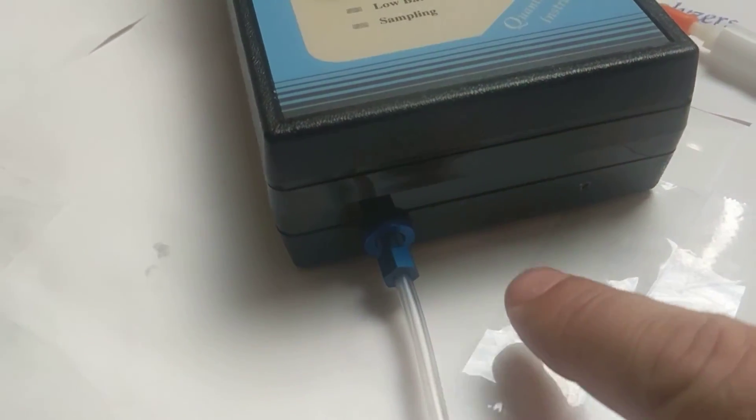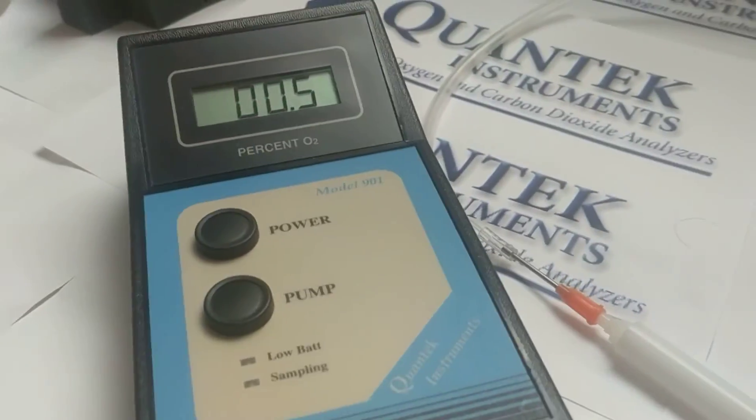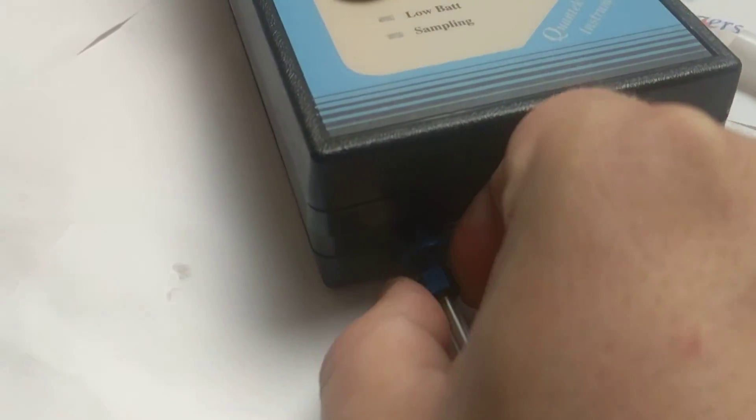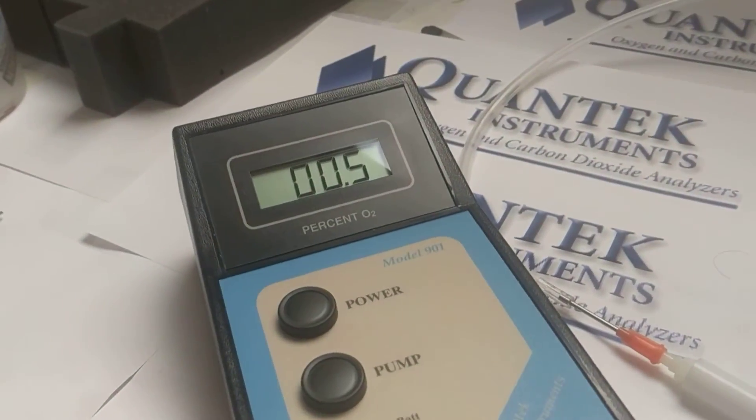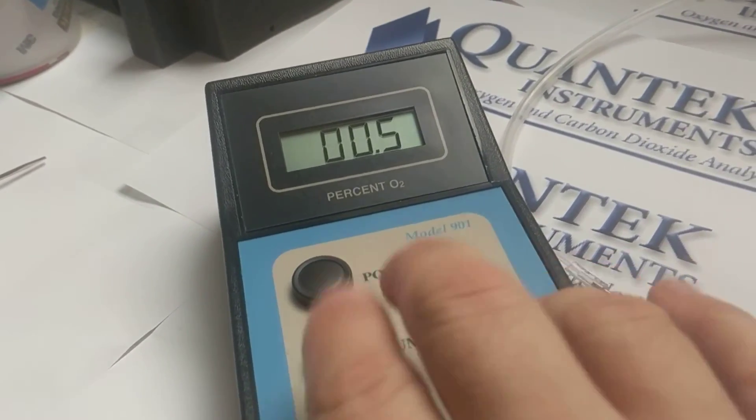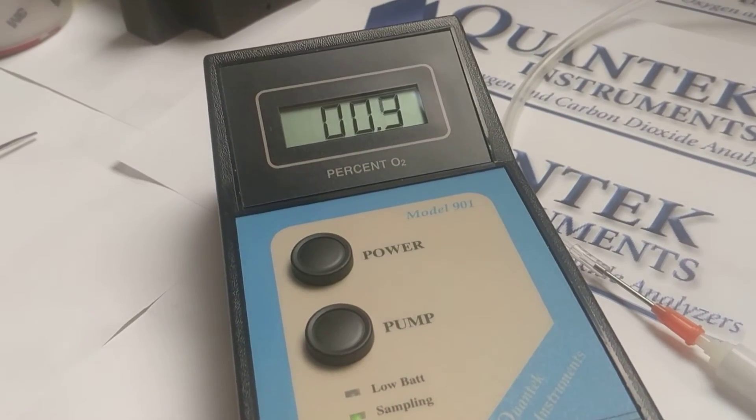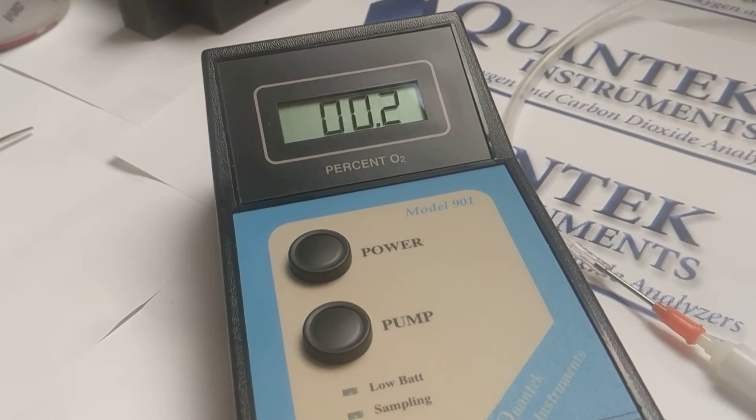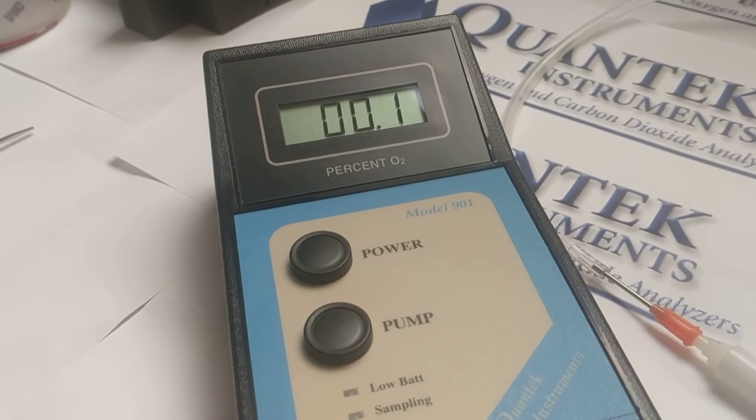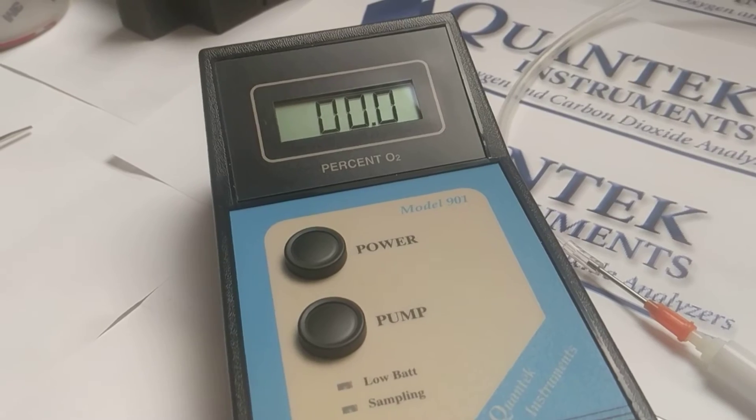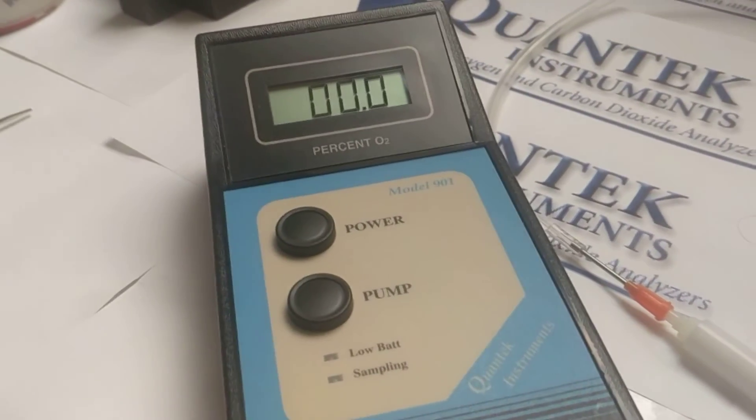So when the pump is drawing in sample, ambient air is getting in through these threads. So we're going to tighten up the threads here a little bit more. And we're going to press the pump button again, and hopefully we should end up at 0.1. In this case, we're off by a hair, but 0.0.